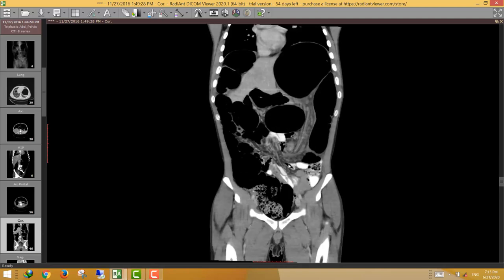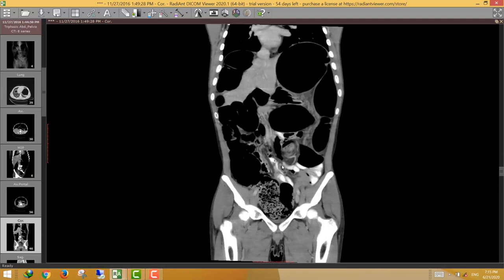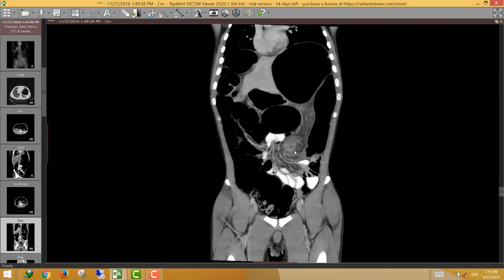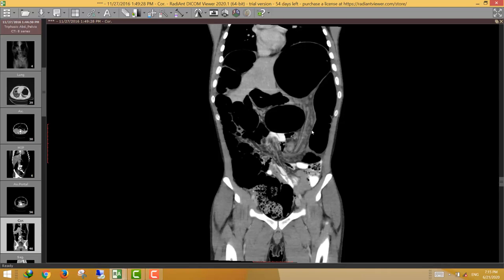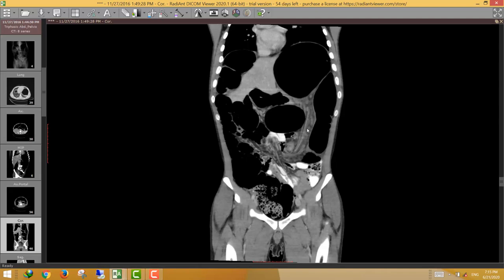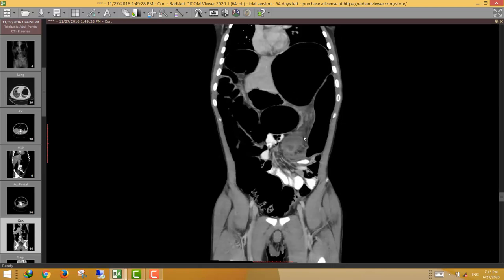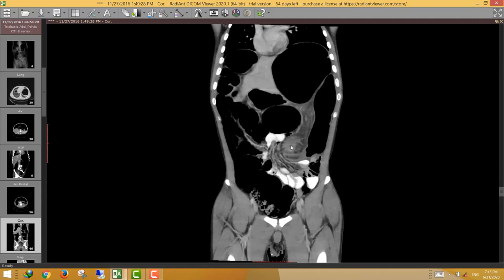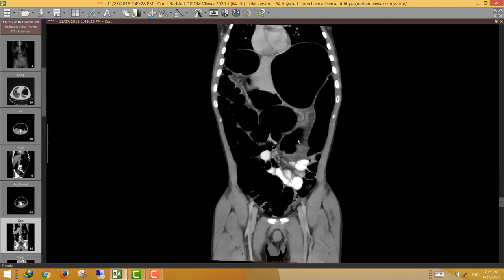In cases of volvulus, look for two things: first, whether the vessels distal to the whirlpool are obstructed — searching for intestinal ischemia, a common complication of volvulus. In this case, there is no bowel wall thickening and the bowel distal to the volvulus is normally enhancing.